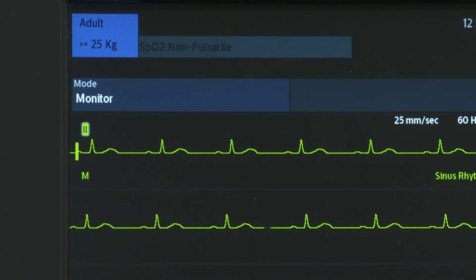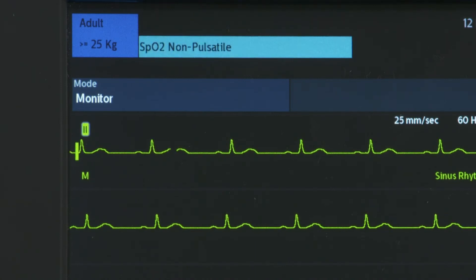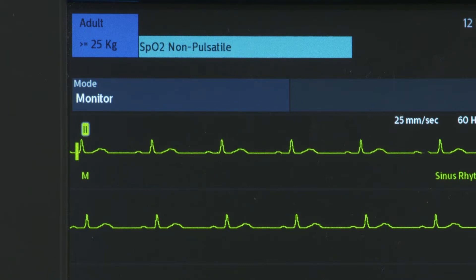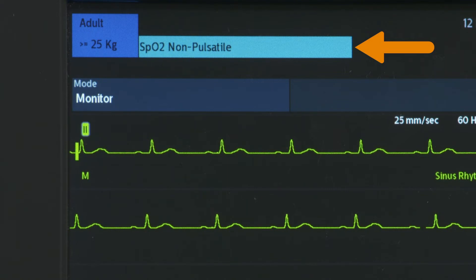Low priority alarms indicate a device problem or non-life-threatening condition, such as an SPO2 non-pulsatile message. They appear with a cyan background.